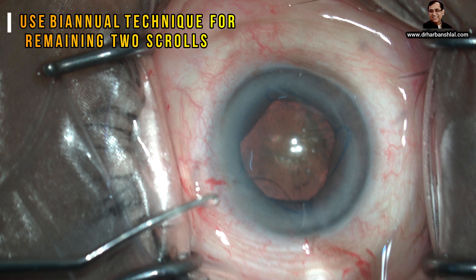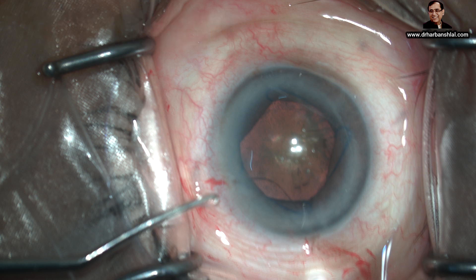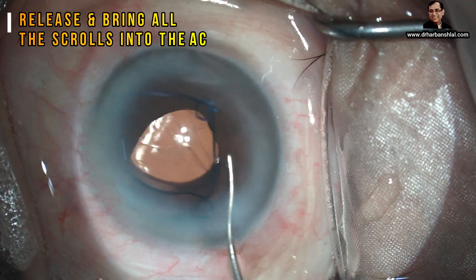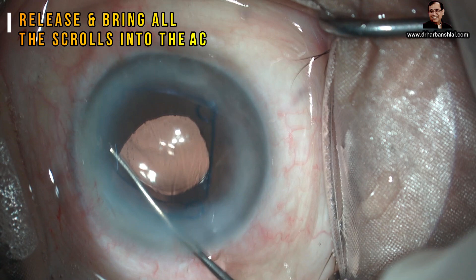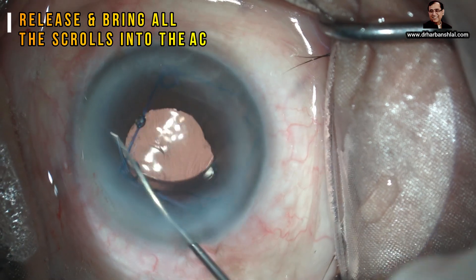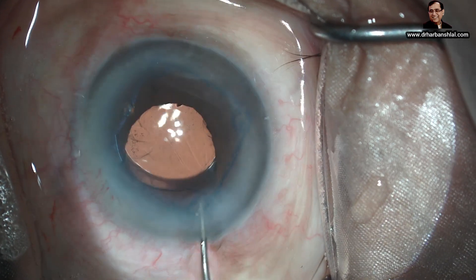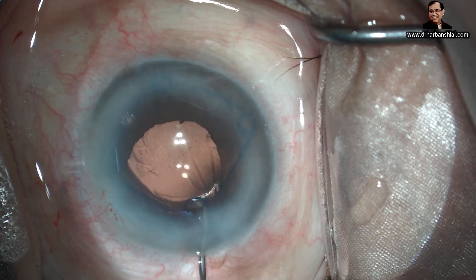Now watch the explant. If you want to reuse the Malugan ring, the ring has to be loaded inside the eye into the barrel. Release all the scrolls one by one and bring the ring into the anterior chamber on top of the iris. If you pull it out directly, all the scrolls will be spoiled.